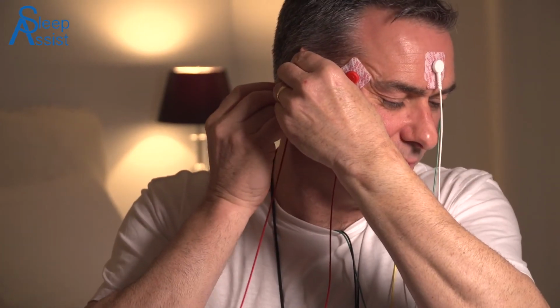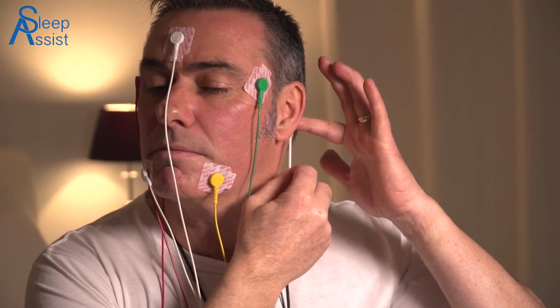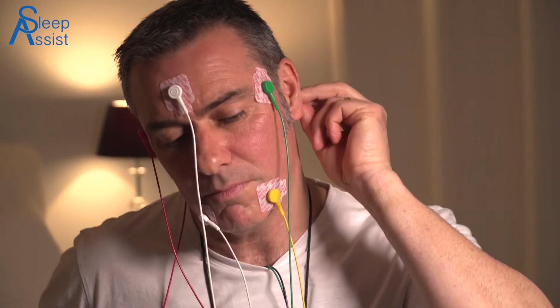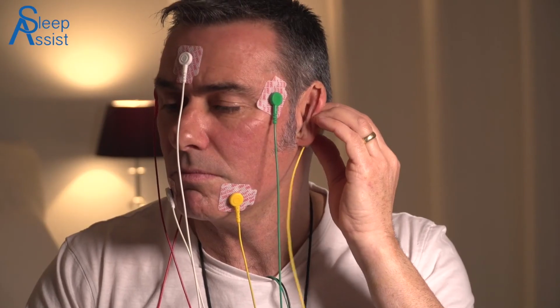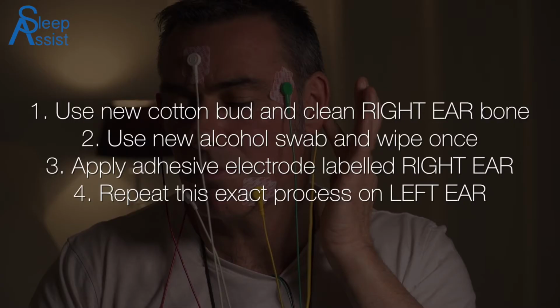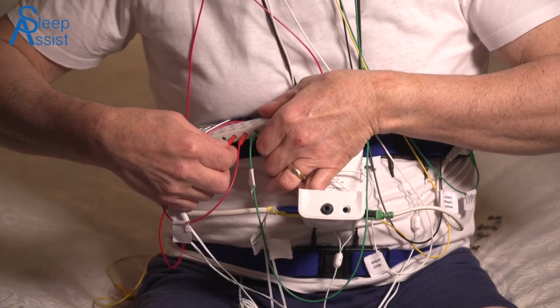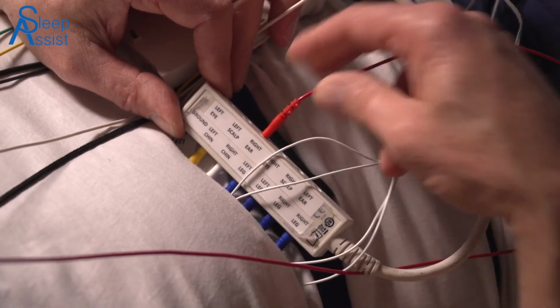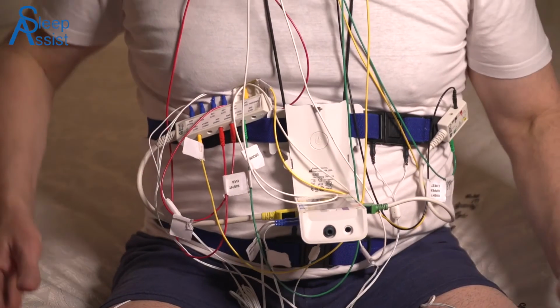Apply the adhesive electrode labelled right ear. Repeat this procedure behind your left ear using a fresh cotton bud and a fresh alcohol swab and apply the adhesive electrode labelled left ear. Insert the lead marked right ear into the multi-lead port box labelled right ear. Insert the lead marked left ear into the multi-lead port box labelled left ear.